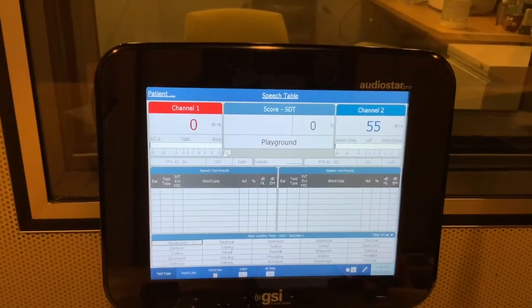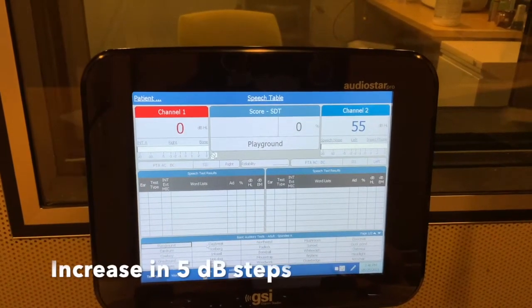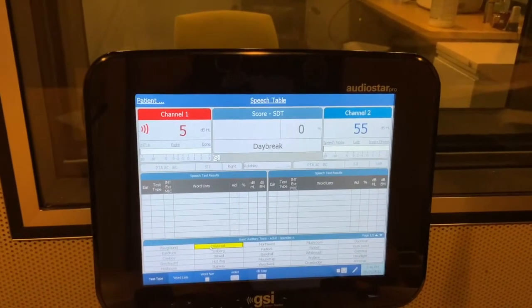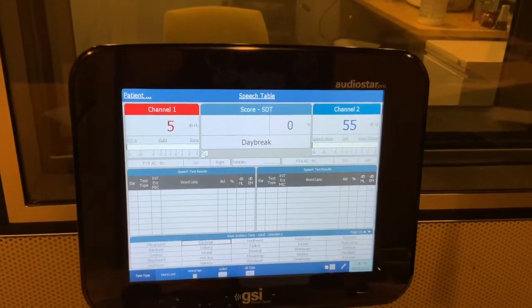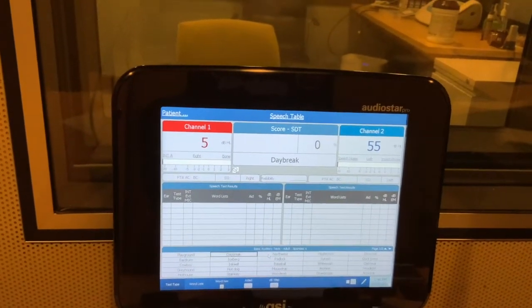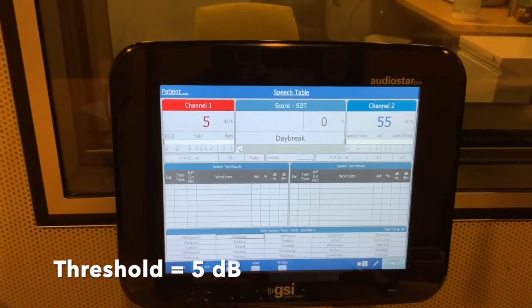If they are not hearing it and they don't detect it, then we're going to go up in 5 dB increments until they do detect it. So let's say that they detect speech at 5 dB HL, then that would be their SDT.